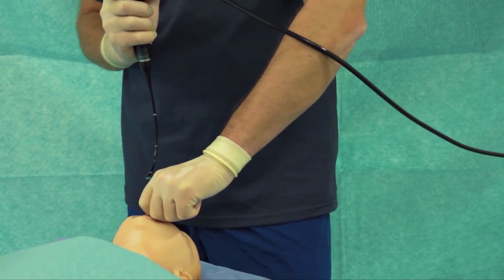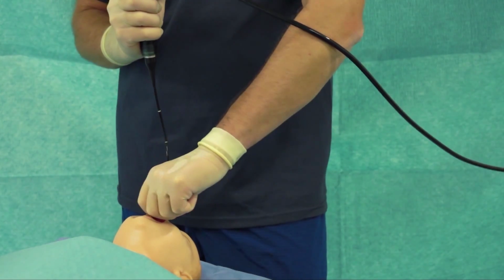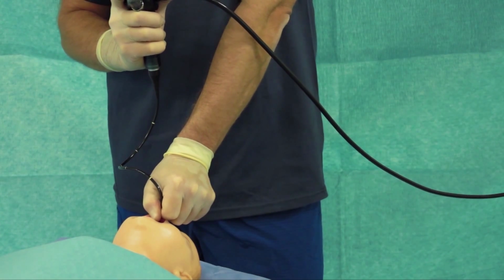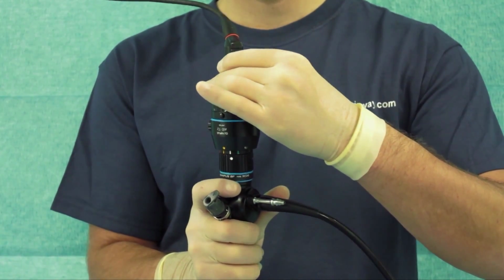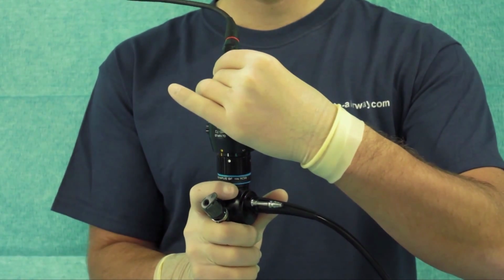Don't let the scope get S-shaped and don't try to turn it with your non-dominant hand, which will be much more difficult. When using a camera, always check that the settings are appropriate, the focus is adjusted and the image is upright.